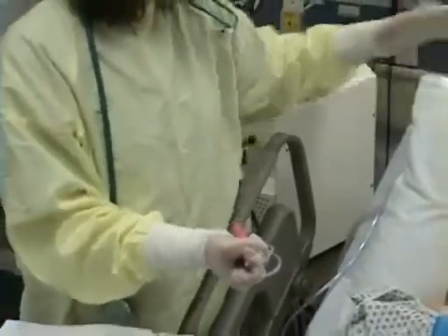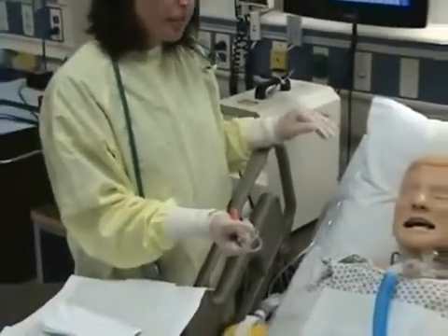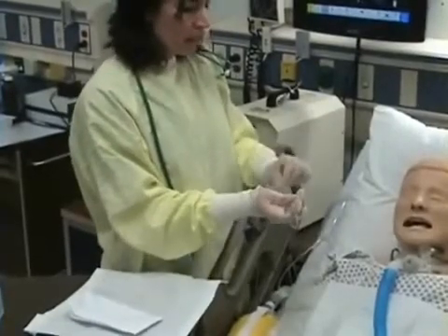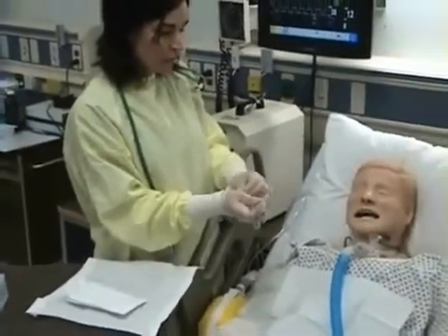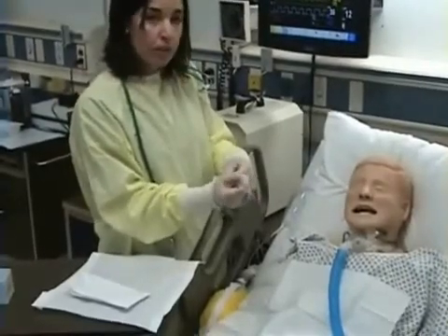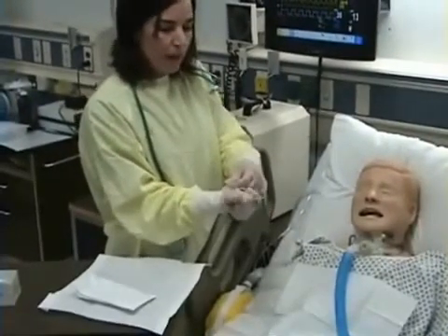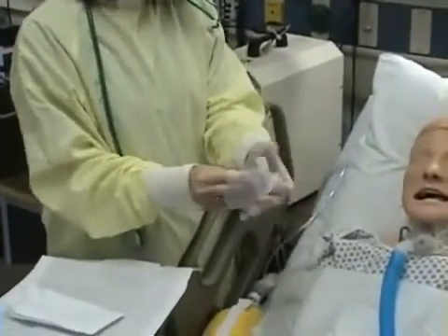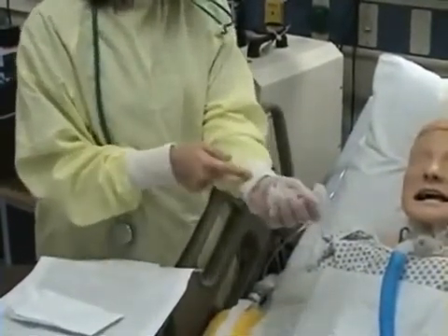As I'm doing this, I'm noting my patient at all times, that their respiratory status is stable, that their pulse oximetry is within normal limits. I'm now going to dispose of my catheter by disposing of it inside my glove and throwing it in a trash container.